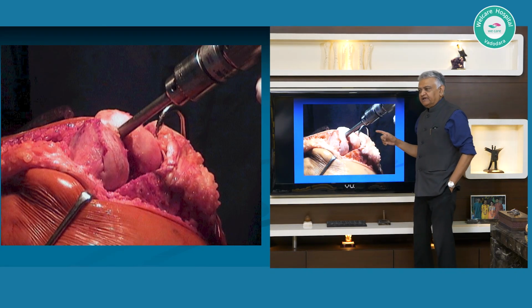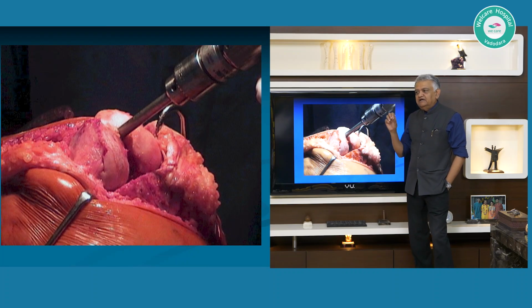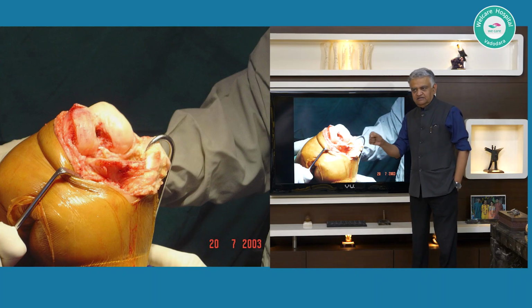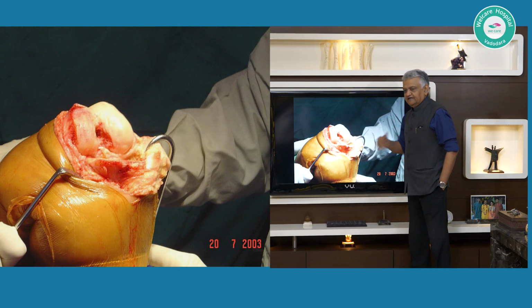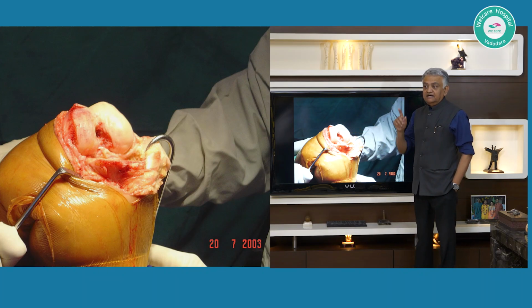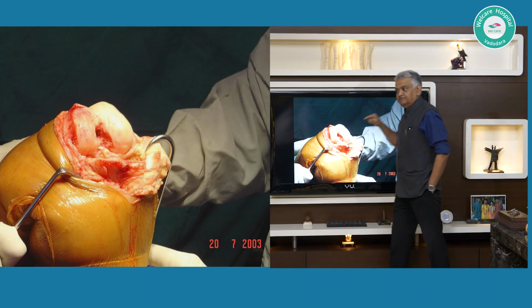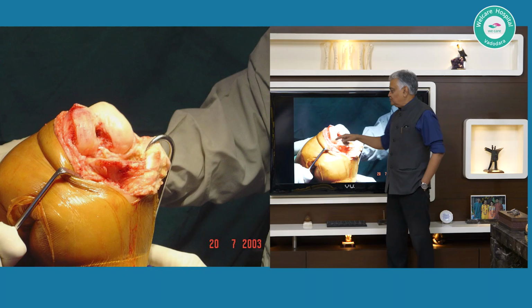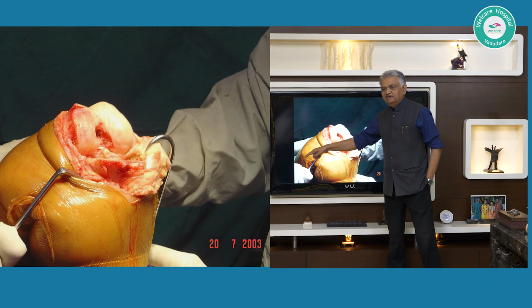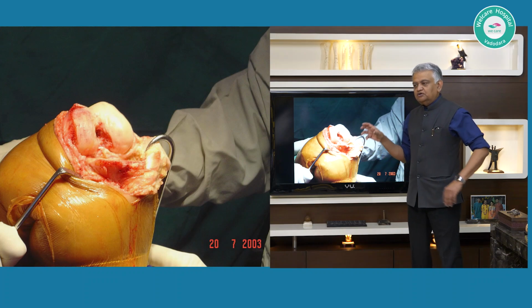And that is why in our theatre it is an inviolable rule that once you open up the mouth of this canal, before you introduce this rod, you will put in a suction catheter, a flexible suction catheter right up to here, and keep on sucking till you start getting red marrow fat, not yellow. There will be yellow here and red here.